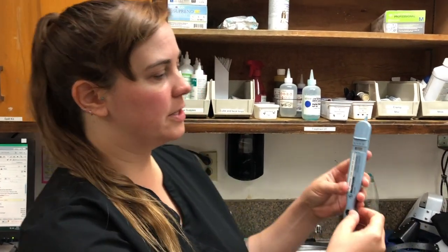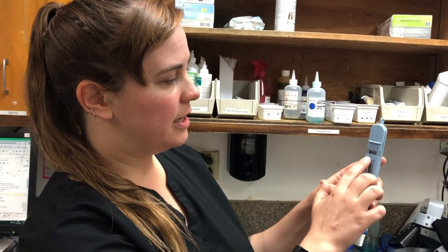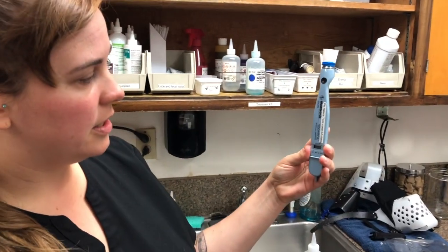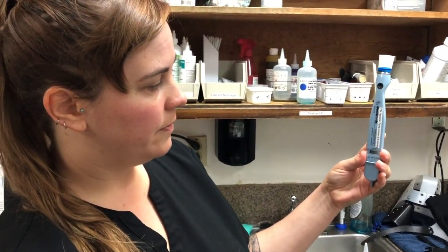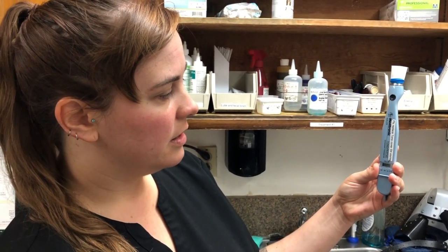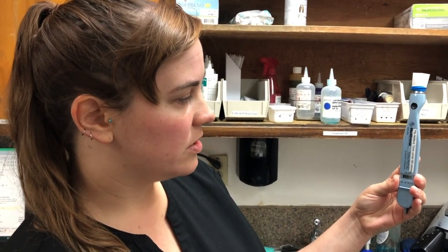So I'm going to calibrate our Tono-Pen right here. So the first thing we need to do, I'm going to turn it upside down and hit our button twice, and it's going to come up with CAL for calibrate. And then once it beeps, turn it up. Got our lines. Wait 15 seconds or so.